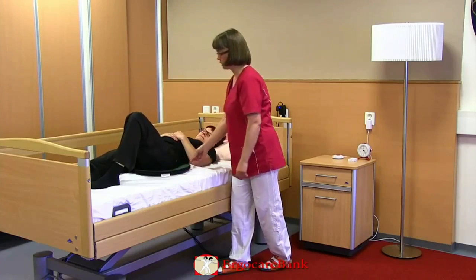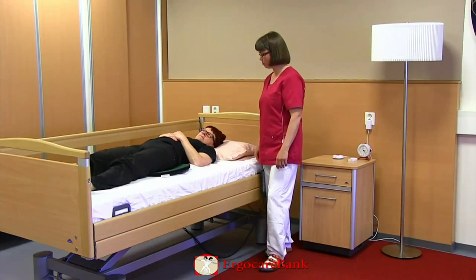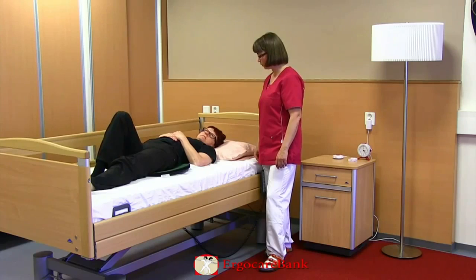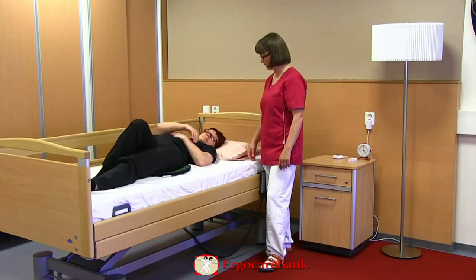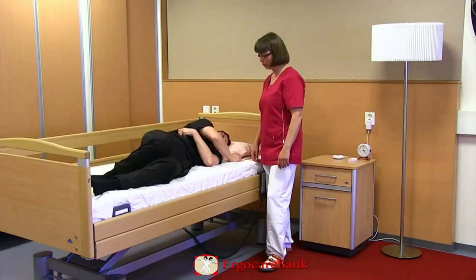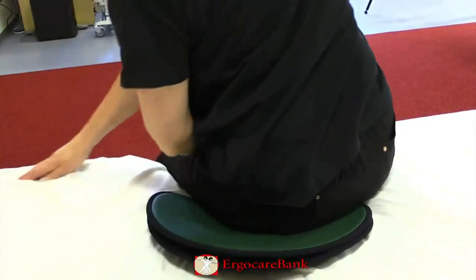Amanda is instructed to bend her right leg, place her arm across her body, and roll over. She swings her legs over the side of the bed, pushes off with her arm, and the disc helps her sitting up.